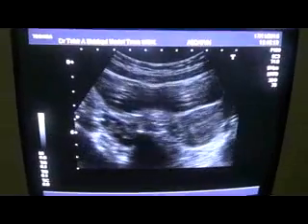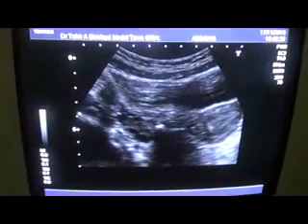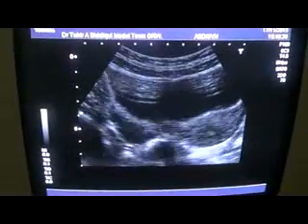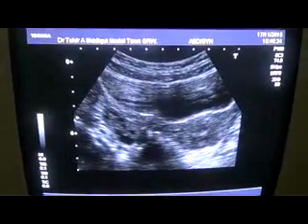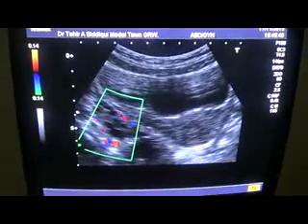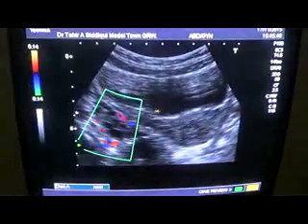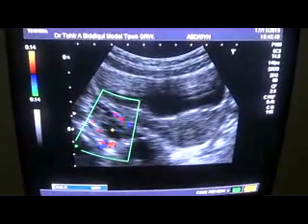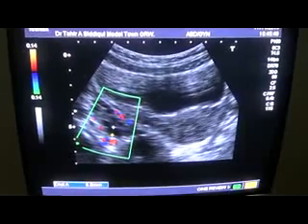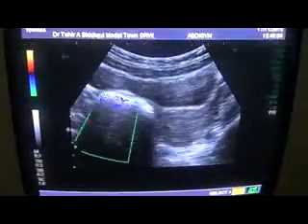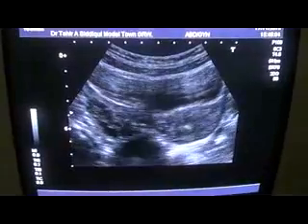To see where the ovaries are, I am moving the probe a bit to the right. First the longitudinal section, then the transverse section, and now I am moving towards the right side and downward, and I get the ovary straight away. In this ovary you can see the follicles — one, two, three, four, five, six, seven follicles are seen. The largest is measuring 6.5 mm in diameter. This is the right ovary.